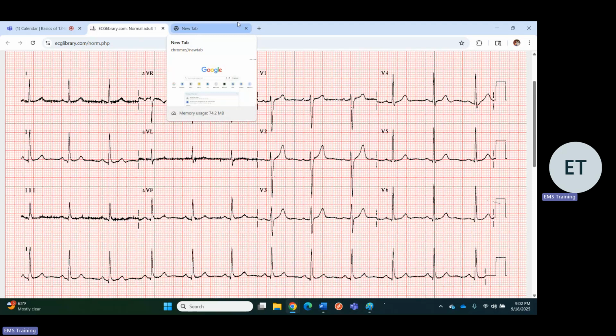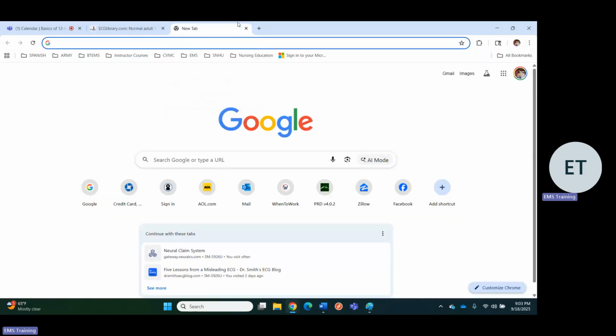In the presence of potential cardiac symptoms or definitive acute coronary syndromes, an abnormal ECG, especially one that changes from one ECG to the next, is oftentimes problematic and should be considered clinically significant until ruled out by troponins, and maybe even ruled out by cath in certain instances if it's not a full-blown STEMI or whatever.